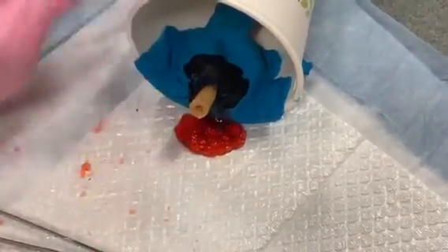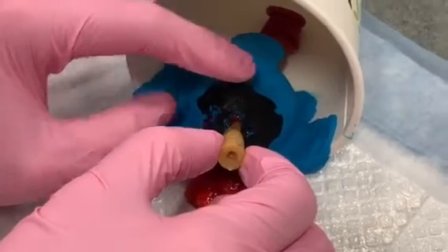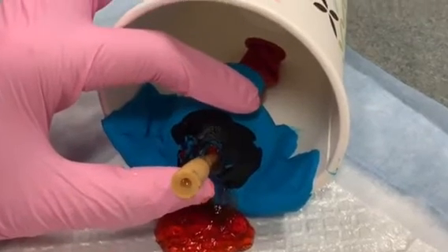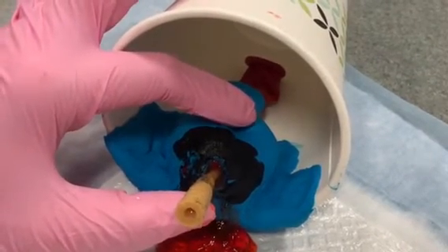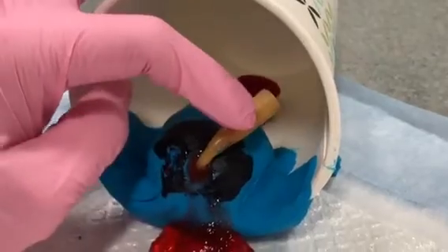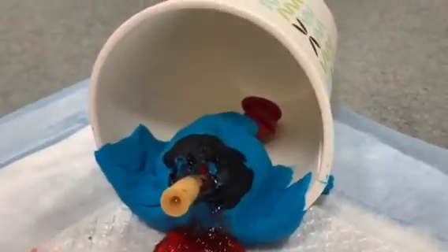The catheter is now in place. It's blown up and it has created a tract for the cyst to drain. You will then tuck the catheter into the vagina, and it usually sits there for 4 weeks, though it can fall out earlier.